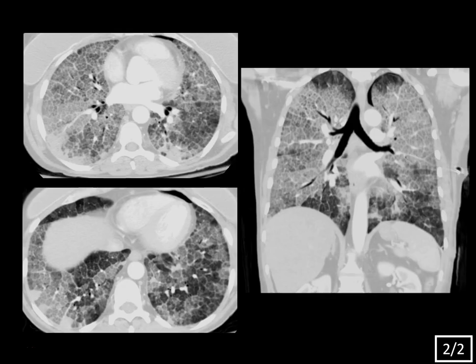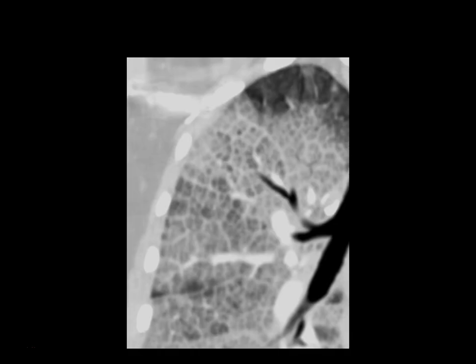Looking at the CT scan, there's extensive smooth interlobular septal thickening with overlying diffuse ground glass opacity. Ground glass means an opacity that you can see through — you can see the underlying bronchovascular structures, similar to looking through a smoky pane of glass — compared to airspace opacity, which you can't see through; that's a dense consolidation. There's also a small left apical pneumothorax, a nonspecific finding seen in chronic interstitial lung disease. Zooming into the coronal reformatted image, you can better see the interlobular septal thickening and overlying ground glass opacity. This pattern is known as crazy paving.